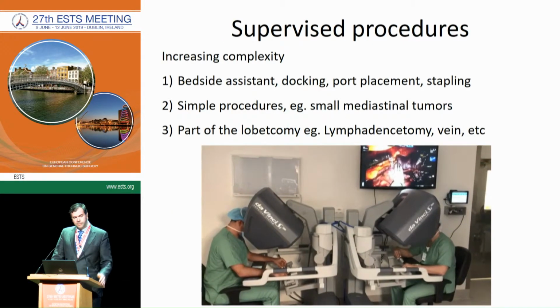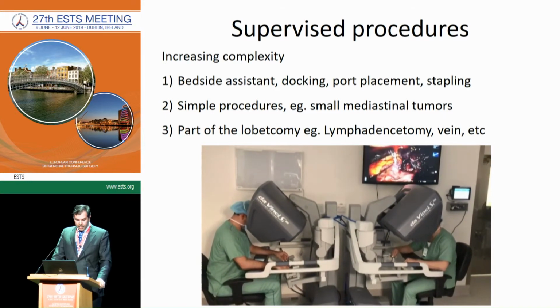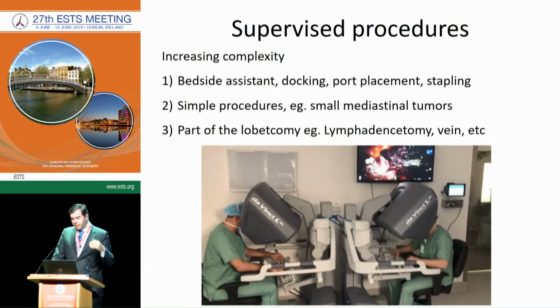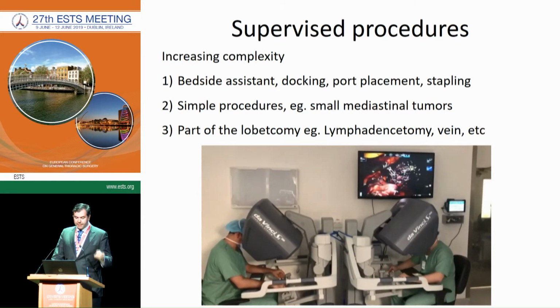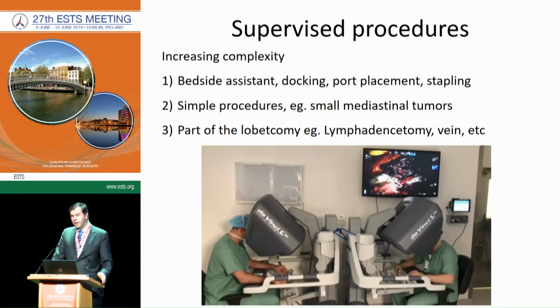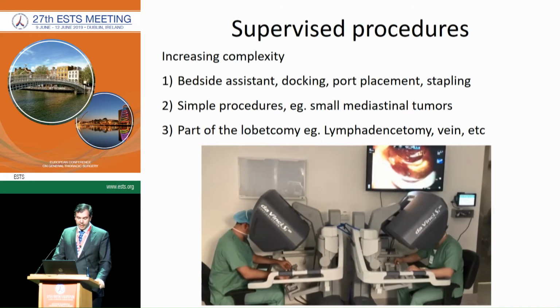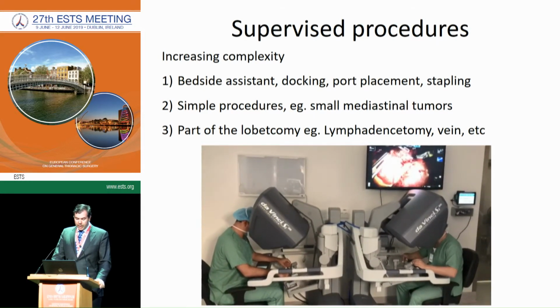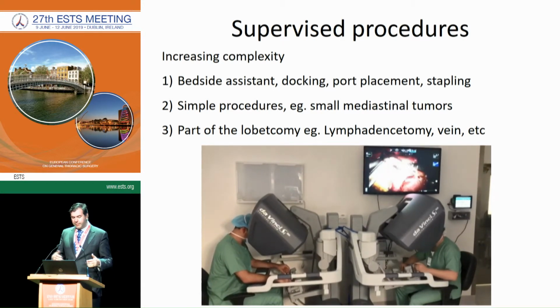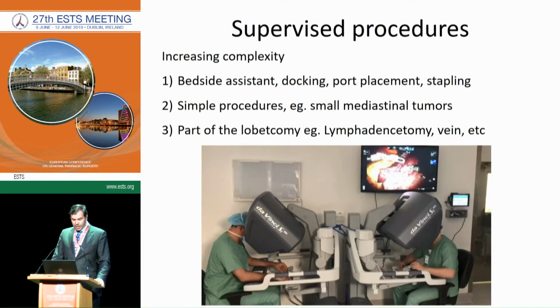Supervised procedures should be offered to residents in an increasing complexity. They start as bedside assistants, so they practice docking, port placement, stapling, and after participating in 10 to 20 cases, we feel that they are able to move on to simple procedures like small mediastinal tumors, and then to more complex procedures like parts of lobectomy, like lymphadenectomy, dissecting the vein, and so on.